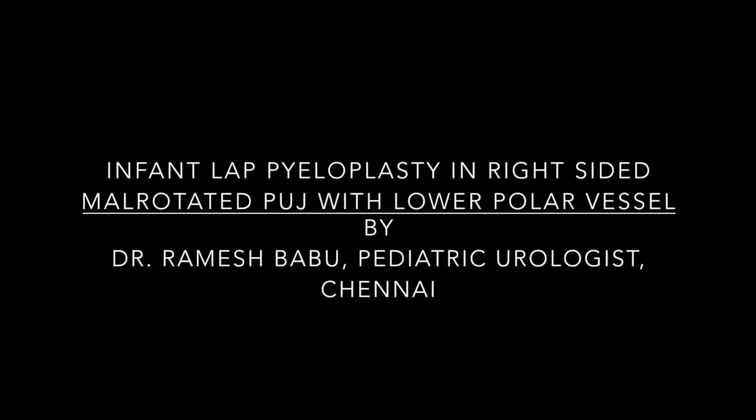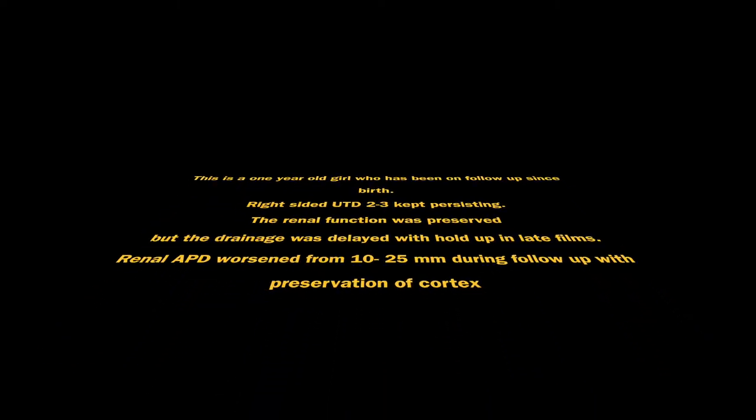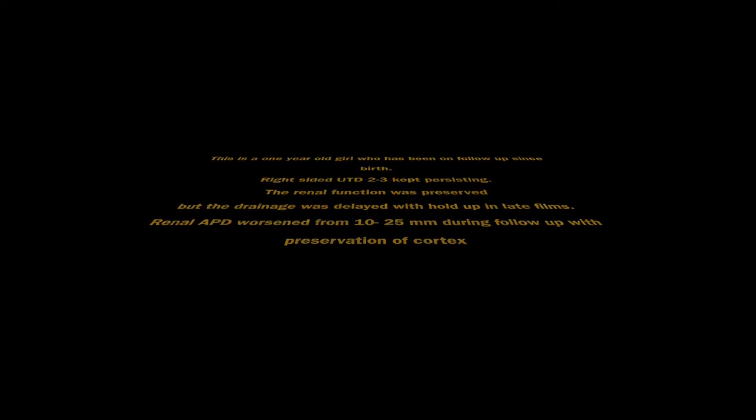In this video we will see an infantopyeloplasty for a right-sided malrotated PUJ obstruction. A one-year-old girl presented with right-sided urinary tract dilatation which kept persisting, and there was a hold-up in late films. There is preservation of cortex and renal function.